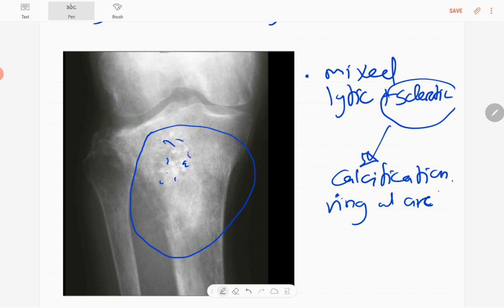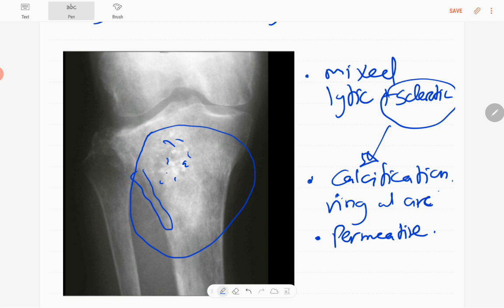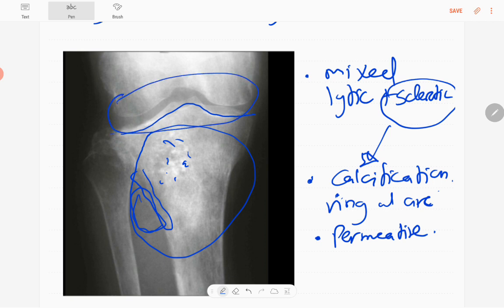The ring and arc type of calcification is present, and it is a permeative lesion, which is an aggressive feature. There is cortical breach and a possible soft tissue component. The lesion extends to the physis with no pathological fractures. The articular surface of the knee joint is spared, and the knee joint and fibula appear normal.